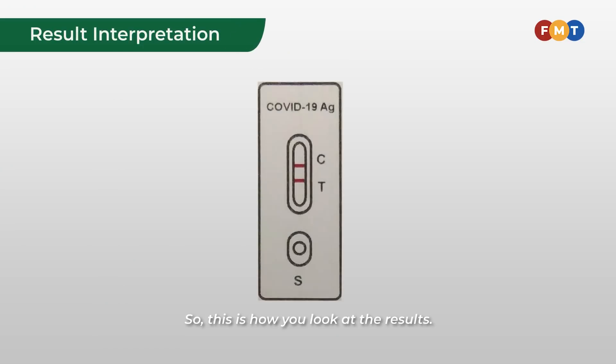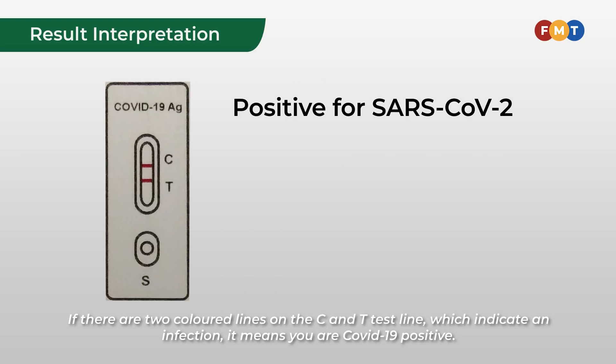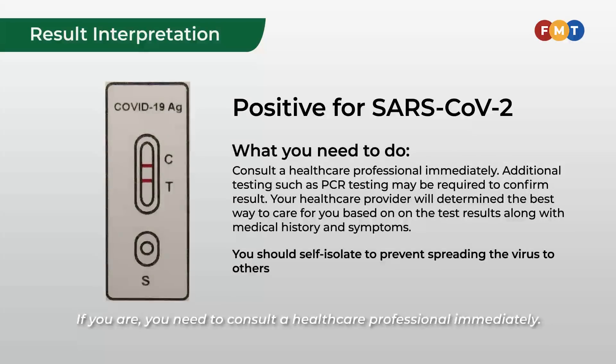This is how you look at the results. If there are two colored lines on both the C and T lines, which indicate an infection, it means you are COVID-19 positive. If you are, you need to consult a healthcare professional immediately.